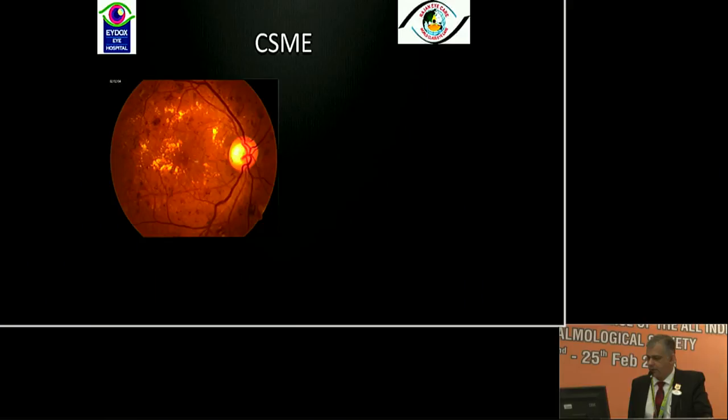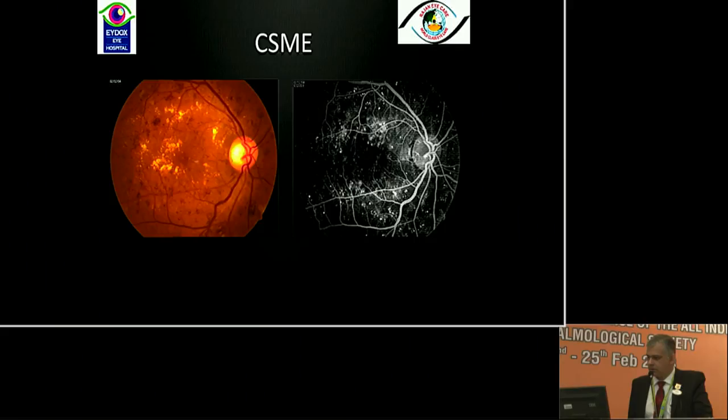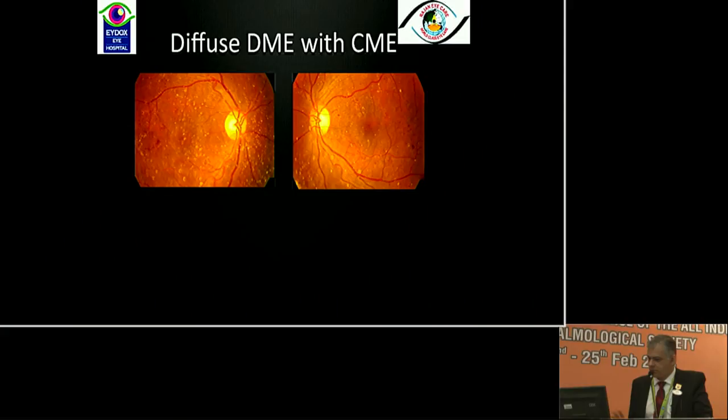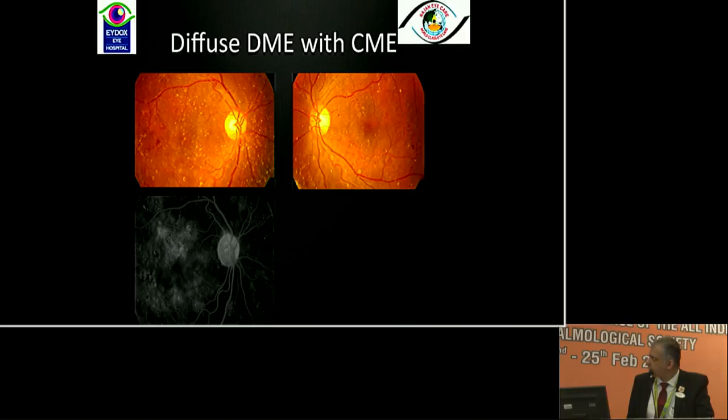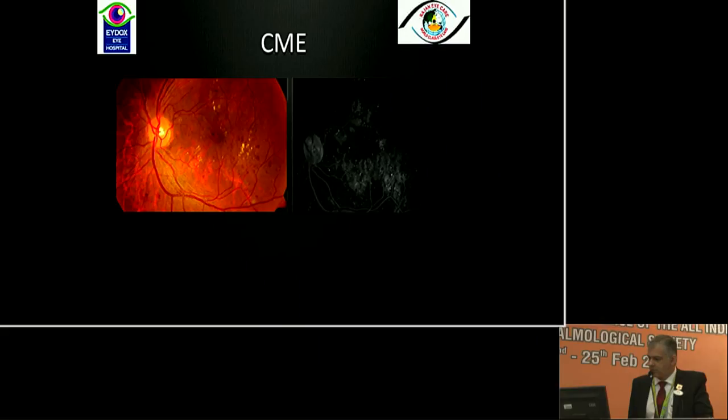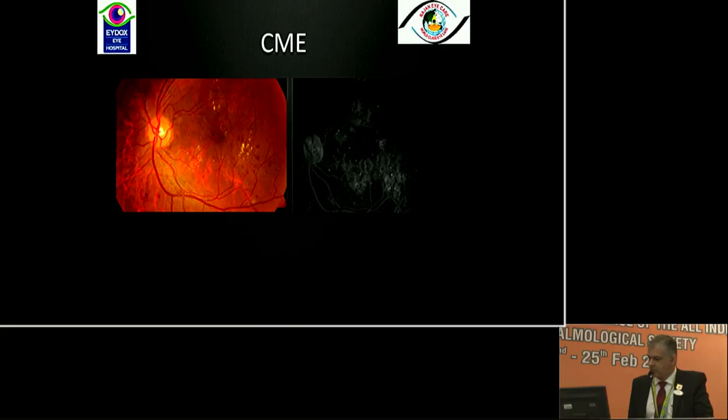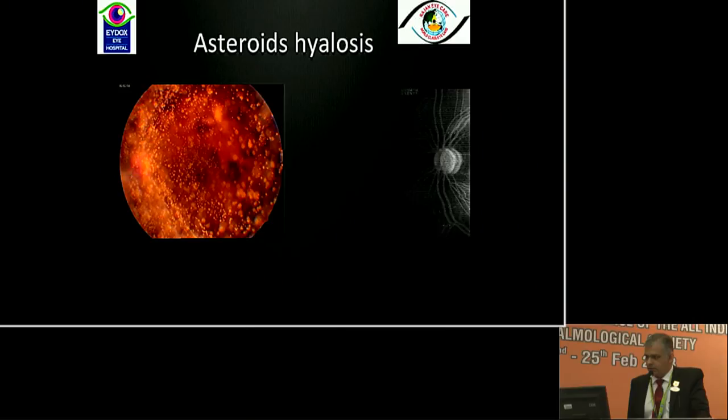Unexpectedly, non-clinically seen neovascularization can appear on angiogram. This patient has a CME which is diffuse in nature and needs an angiogram to start treatment. In diffuse DME not seen severely clinically, angiogram can also reveal good amount of cysts and macular edema. Where you are not certain of how much exudation or leakage is there, it is better to get an angiogram done. OCT has changed how we look at ischemic retina, but angiogram still has a role in challenging scenarios.